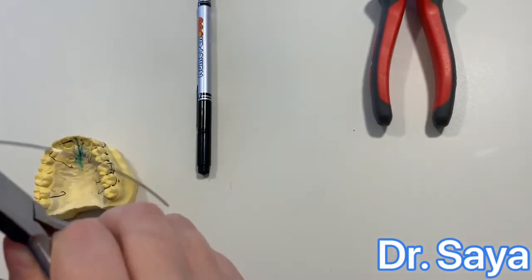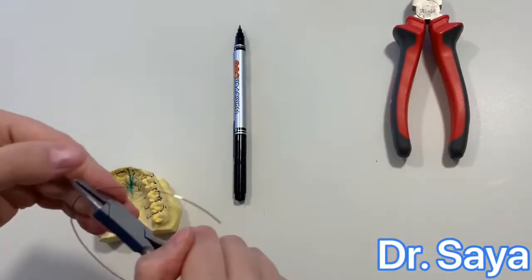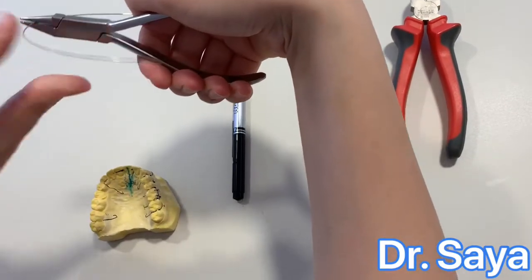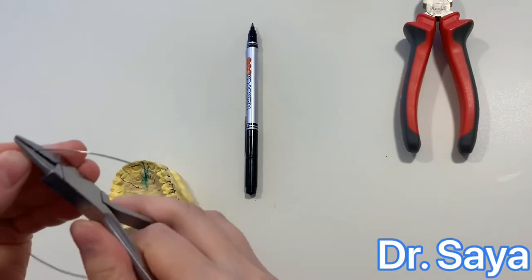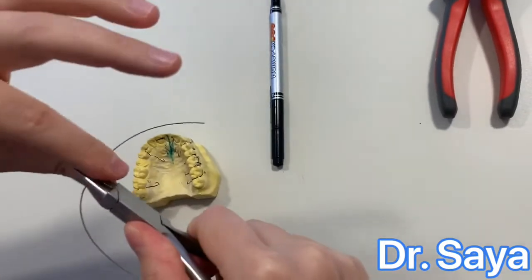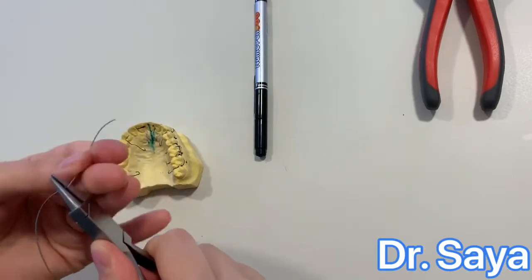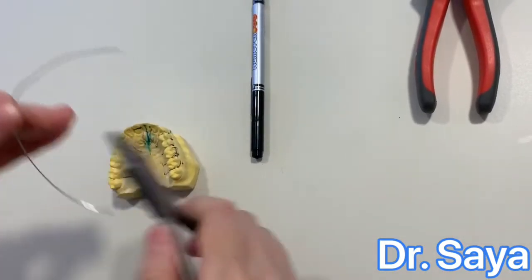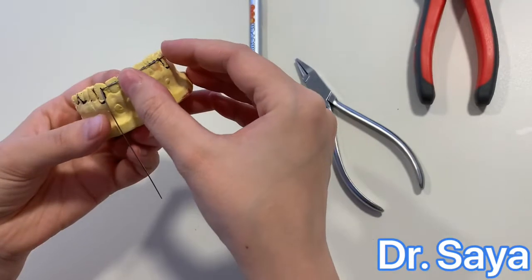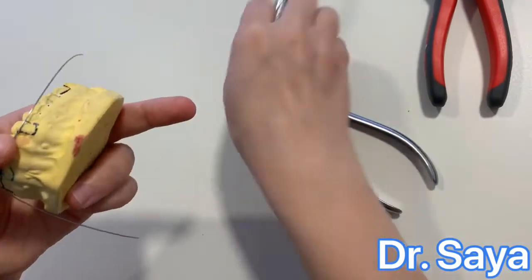Hold the plier before the mark we made, making sure the plier and the wire are at the same plane. Do not tilt it up or down — the wire and the plier must be at the same plane. Hold it before the mark made for the straight side and make a 90-degree bend, then straighten the piece of wire. Check the result on the cast. When this side is done, repeat the same thing for the other side.